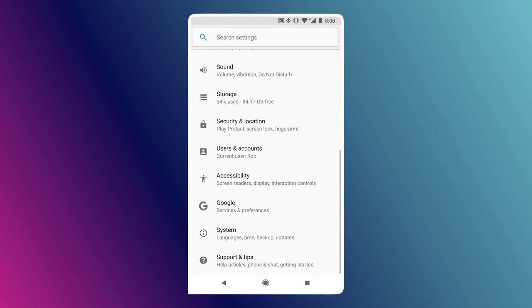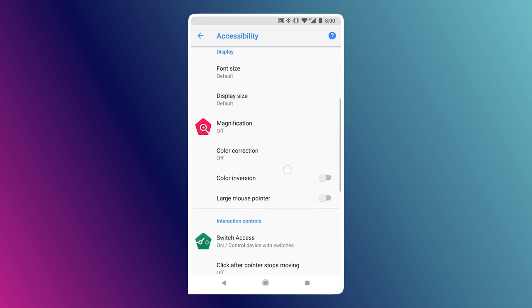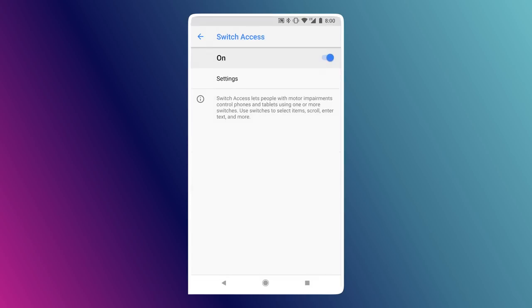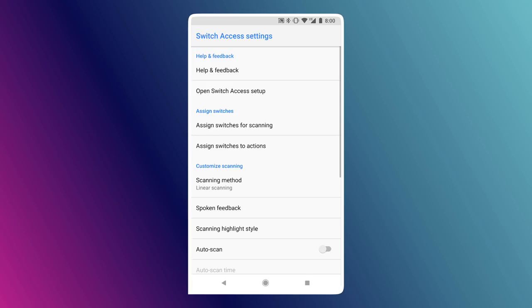If we go into our accessibility settings on our phone, we can go down to where it says Switch Access, make sure our device is turned on, go into Settings, and we can assign actions to these switches.